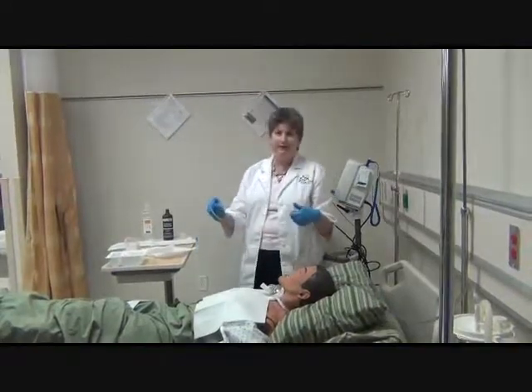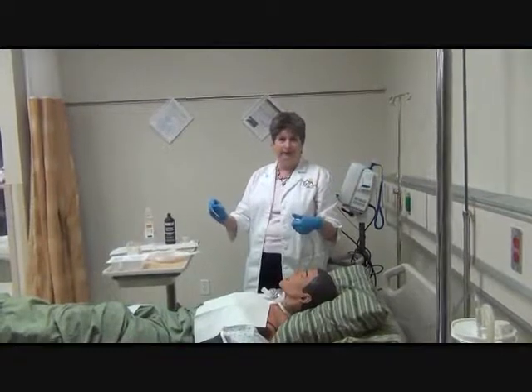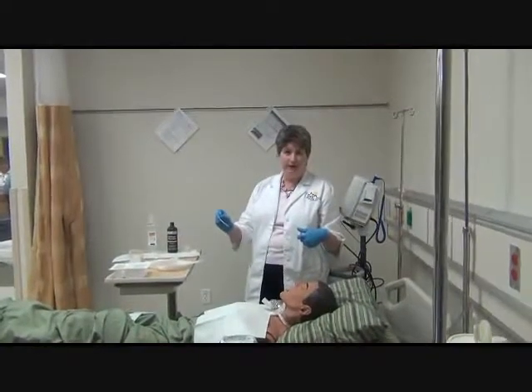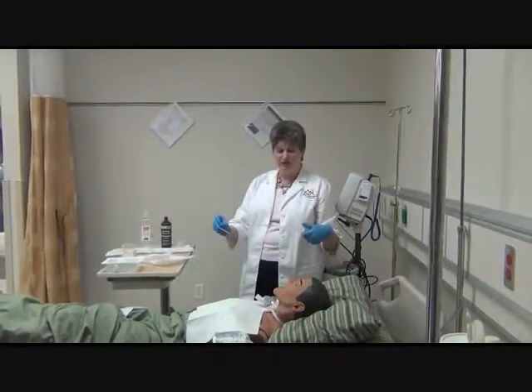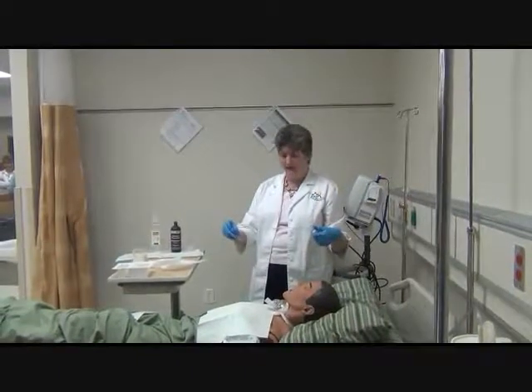I only want to make 3 passes with the trach. Usually that'll do it for you, but if their SATs are not coming out, you may have dislodged some mucus clots or something, you may have to do a 4th time, but usually you don't have to. Just judge your patient.